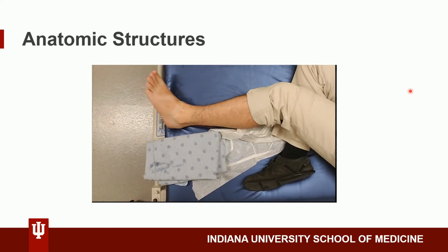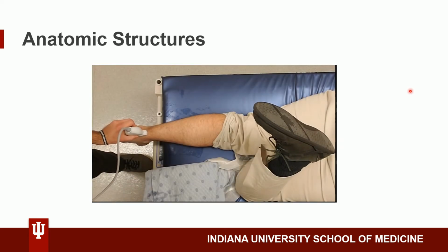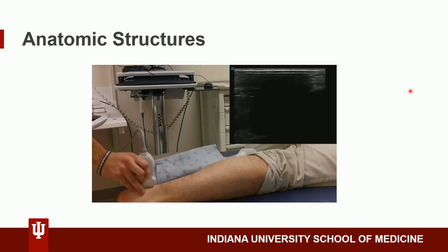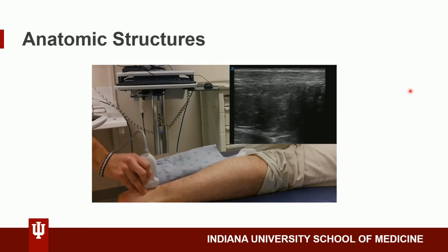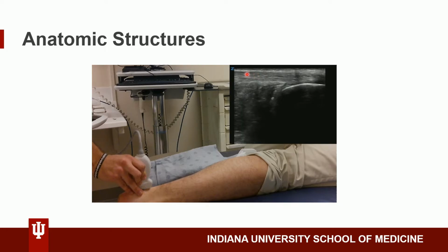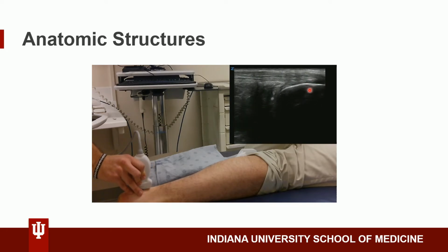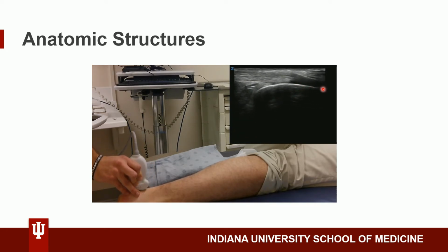The patient now rotates to lie prone in order to grant us direct access and visualization to the Achilles tendon. Placing the probe longitudinally, we immediately see the typical tendon architecture of parallel fibers running, and we can trace it superiorly and inferiorly as well to the site of insertion along the calcaneus, which is denoted by this smooth hyperechoic cortical line.